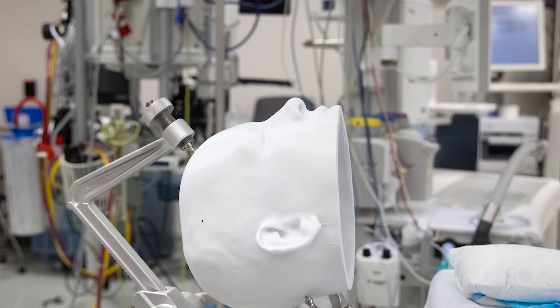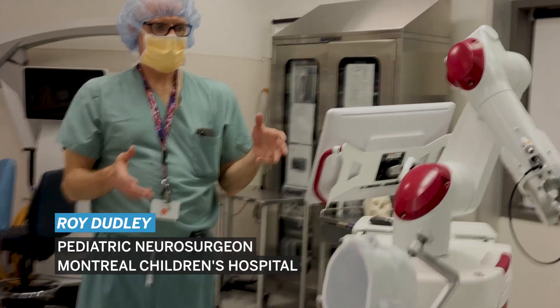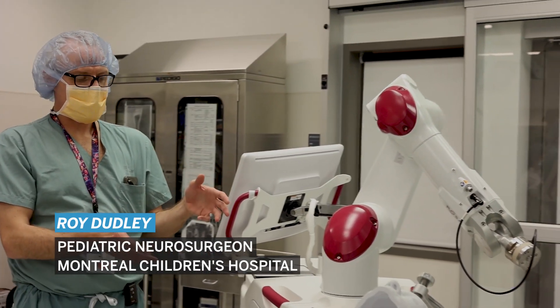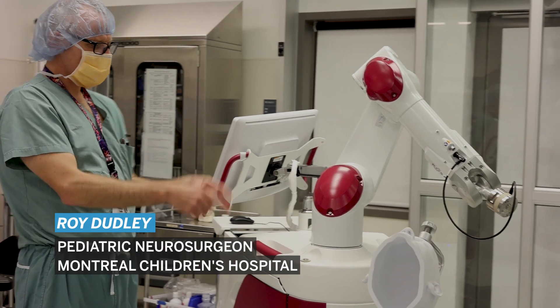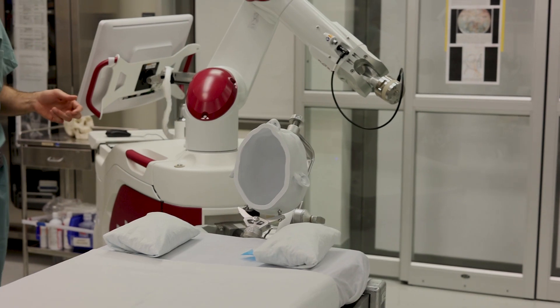The patient is asleep and intubated. We connect the patient's head to this Mayfield head holder, we connect that to the Rosa — to the robot — and then we also connect the head holder to the bed.